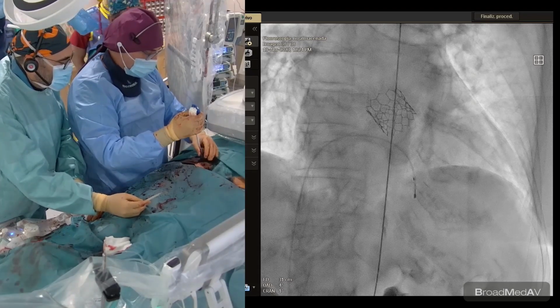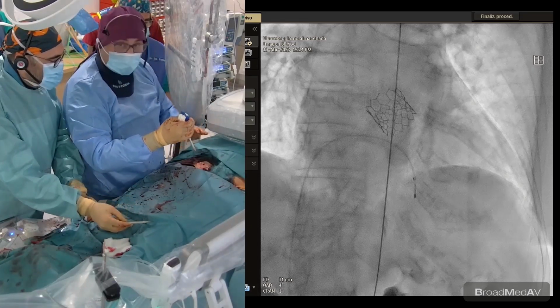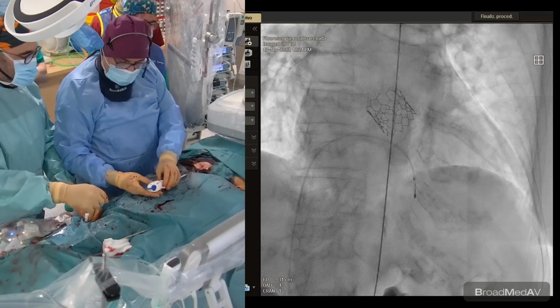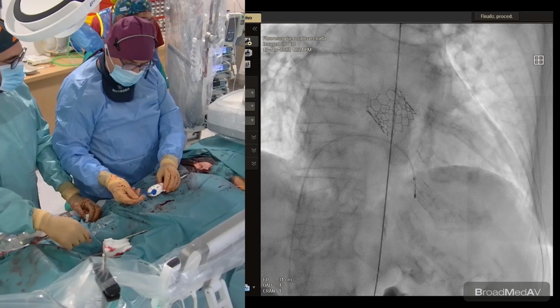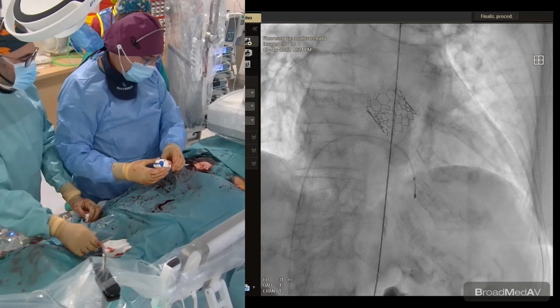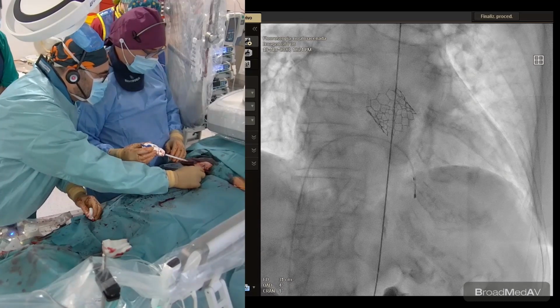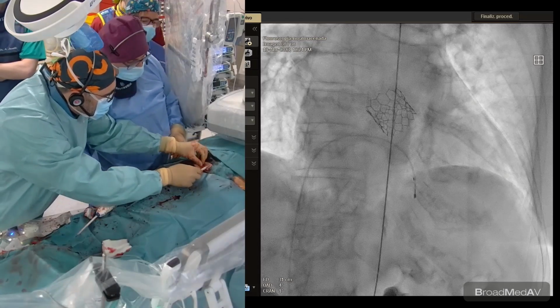Okay. Now we go back with the blue part. We check if in theory it's okay. Slowly, because it's the stressed wire. They are retrieving the wire. We push with the blue part if you want. And we can cut the thread. Yeah.